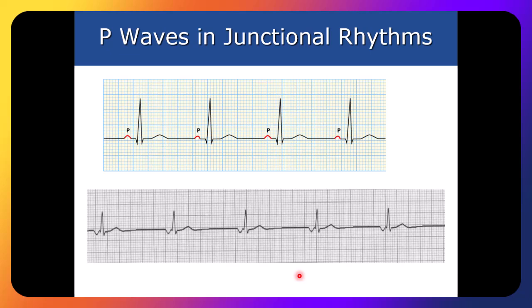It potentially could, but now we know that the P wave is not embedded in the T wave because you could potentially see it if it occurs afterwards, as a part of that T wave. But we know it's not there because we've got a pretty clear indication of these inverted P waves. Look at this P wave. What do you notice?